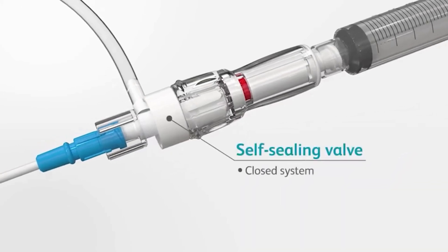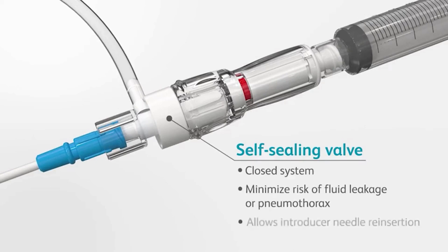A self-sealing valve maintains a closed system and provides protection from fluid leakage and minimizes the risk of a pneumothorax. The resealing membrane of the valve allows reintroduction of the introducer needle if catheter repositioning is desired.